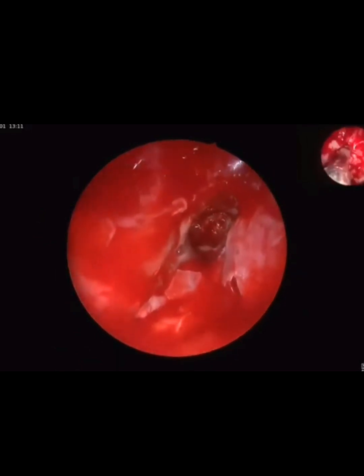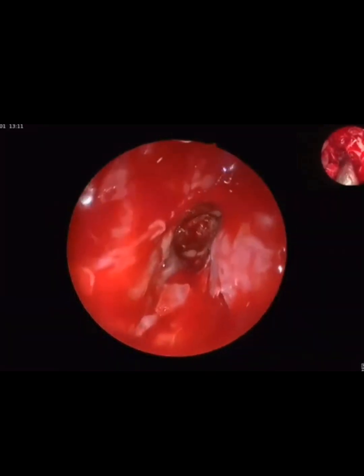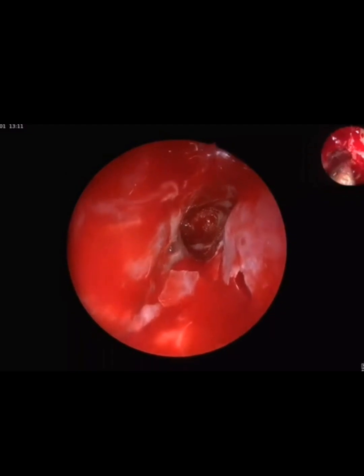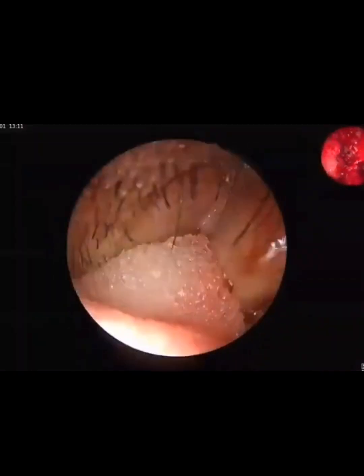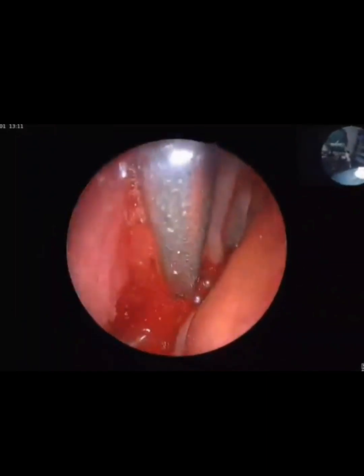See the frontal sinus. Clear? Nice. Very nice. Any suggestions? We can show with external camera also. No, it's okay, later on. Everybody is agreed. Frontal sinus is opened very nicely. Everybody is happy. No need to show the glow. We have all confidence in you. Okay, thank you, sir. Thank you.